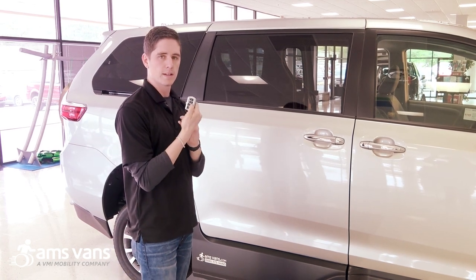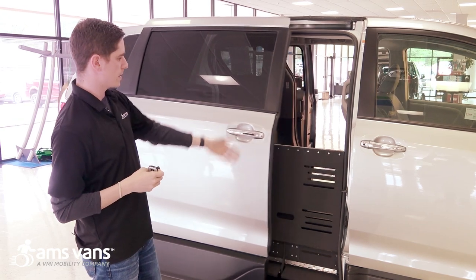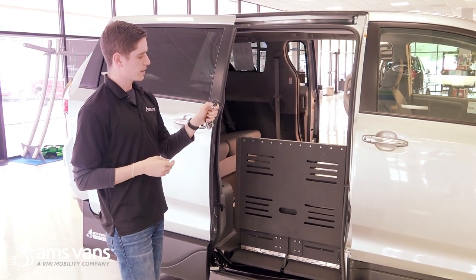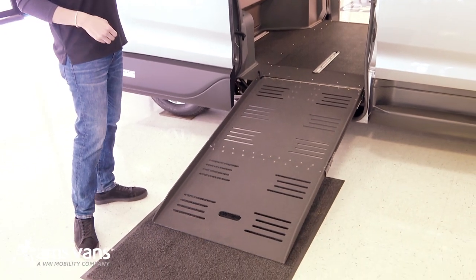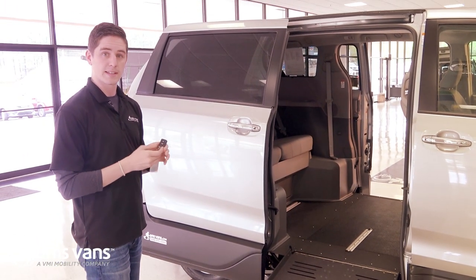What we're going to do is hold this key fob and open up this sliding door right here. You're going to see the power bi-folding ramp here stowed inside the door. What we'll do next is hold the out button and deploy the ramp. You can take your finger off of the control right here and the ramp is going to stop.